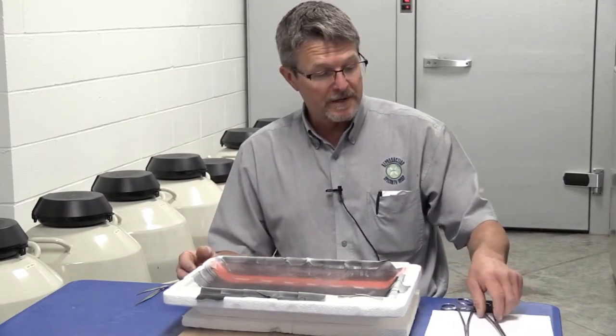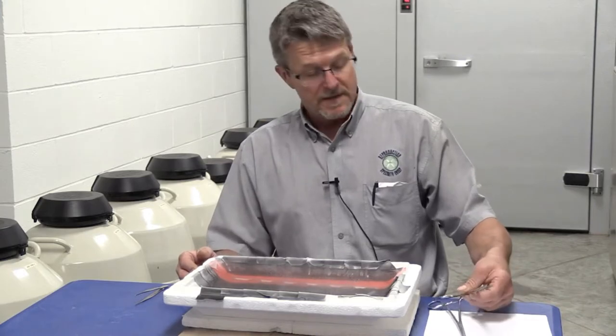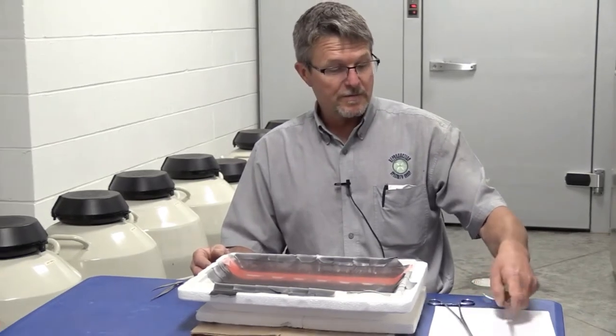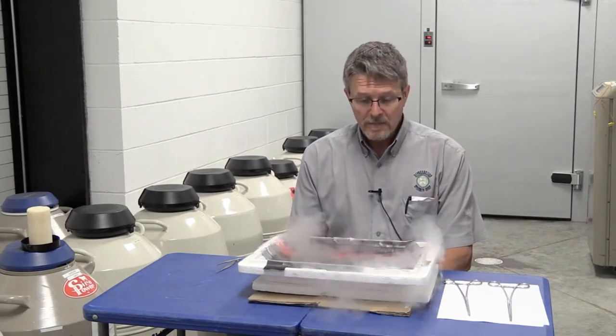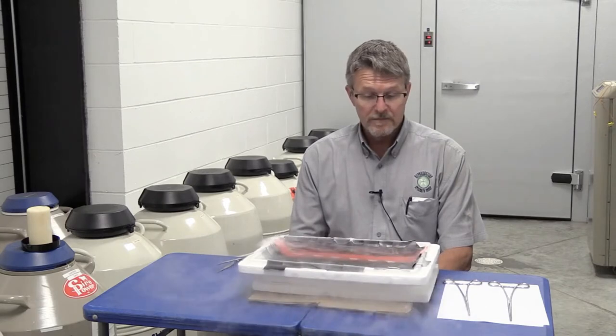As we've talked about in our other videos, one of the major problems we see with semen handling is too much air time, and that is very detrimental to goat and sheep semen. They cannot handle the stress of air time like bull semen can. So everything we do is under liquid nitrogen — there is very limited exposure to the air.